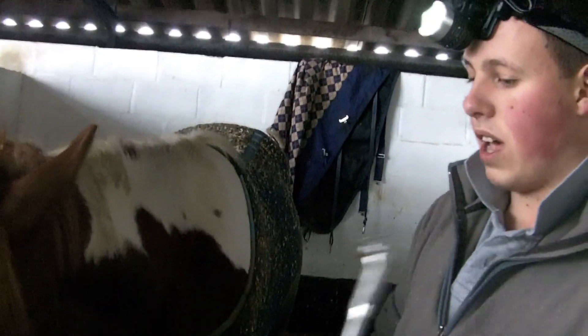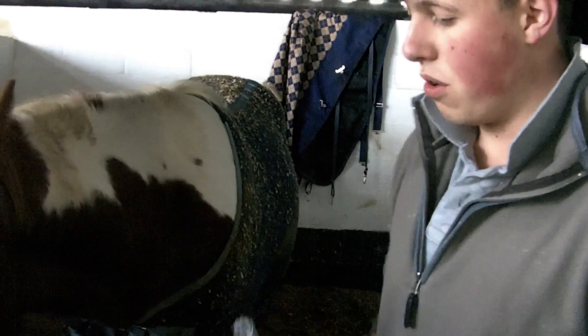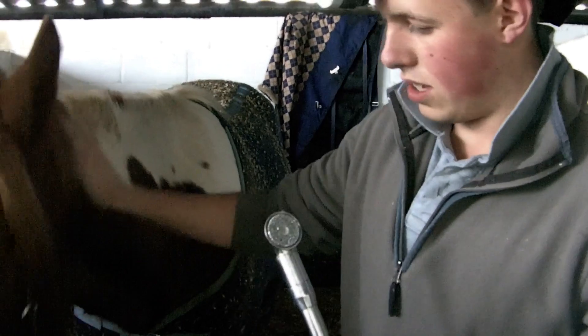And how are his teeth in general? Sharp, 6s to 11s, fairly flat tables, good incisors, no canines, just wolf teeth. Good all in all. We'll just roll the edges, round off the lower 6s so when you do start biting them the cheeks won't roll into any sharp edges.